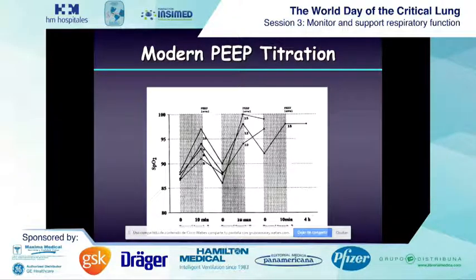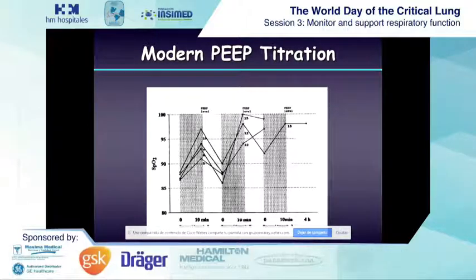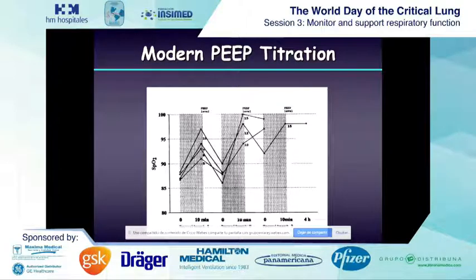I imagine many of you use this technique to select the PEEP in ARDS patients. At least this is the one that I use mostly. On the y-axis there is oxygen saturation, and those are patients that do respond in terms of oxygenation to the recruitment maneuver.